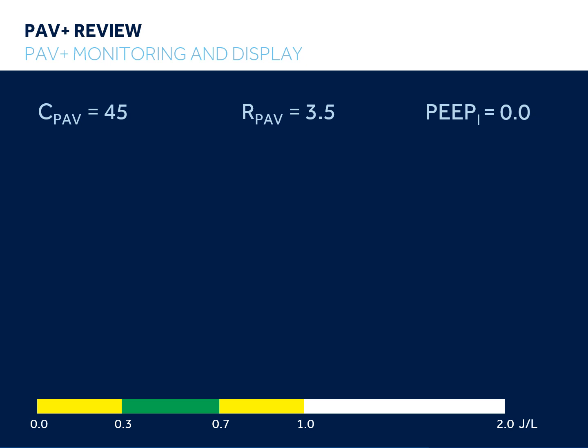Also, since PAV knows airway resistance, flow, and mouth pressure, it can calculate lung pressure. This calculation of lung pressure is displayed as a shadow trace that you may see on the pressure waveform when PAV is enabled. The display of intrinsic PEEP shows the amount of remaining lung pressure as calculated 100 milliseconds prior to the most recent patient effort. PAV Plus displays the patient's static compliance, while other spontaneous modes like pressure support do not. As such, in PAV, compliance can be used to titrate appropriate PEEP levels.